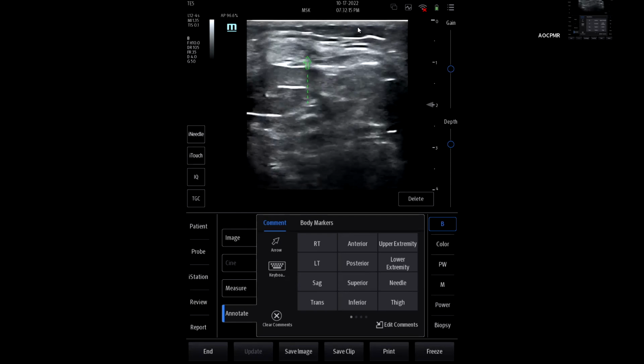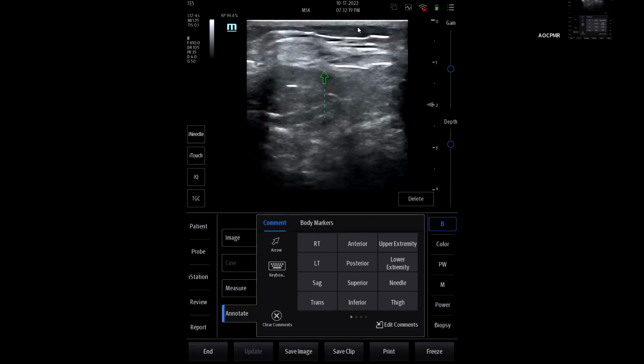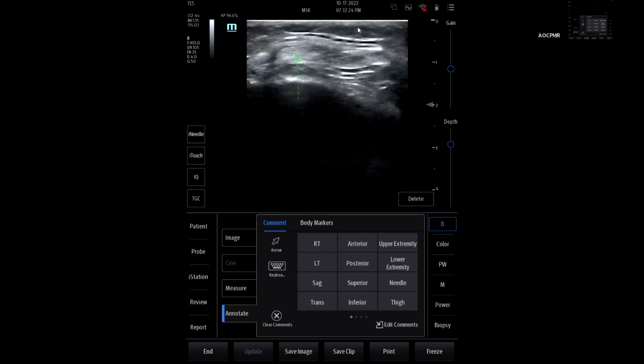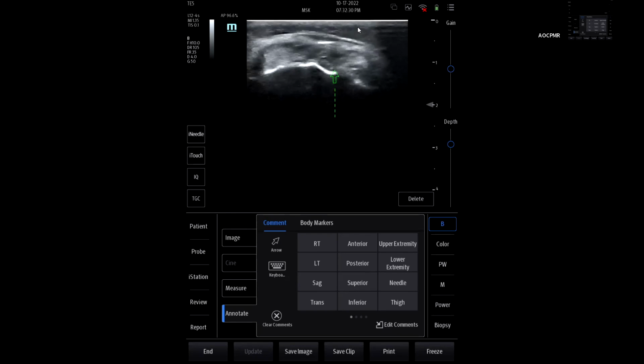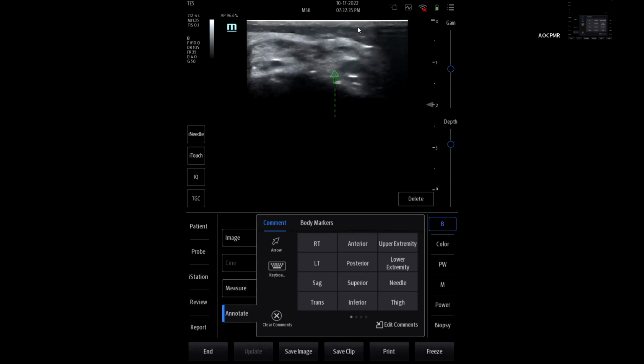So this is all patellar tendon. This is where a lot of it was harvested. I think they cut the middle. Yeah, you can see this is the whole thing, and this is where it's harvested. It's much flatter tendon. You can see where it was.